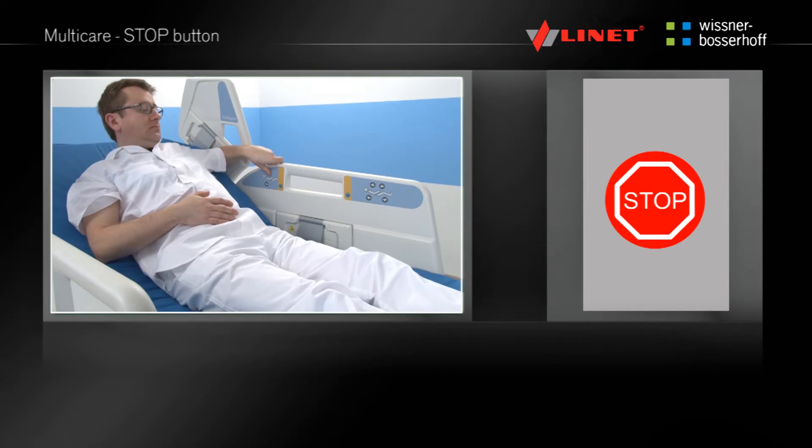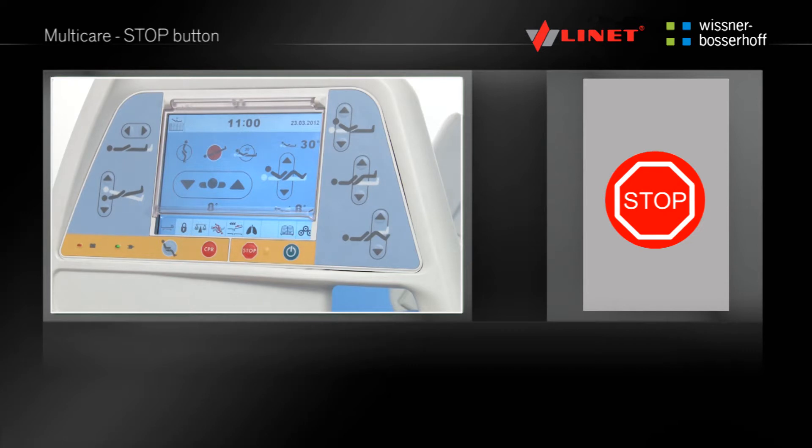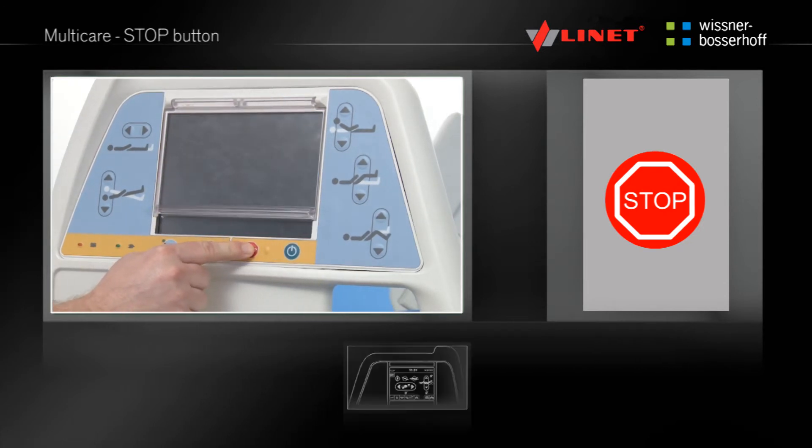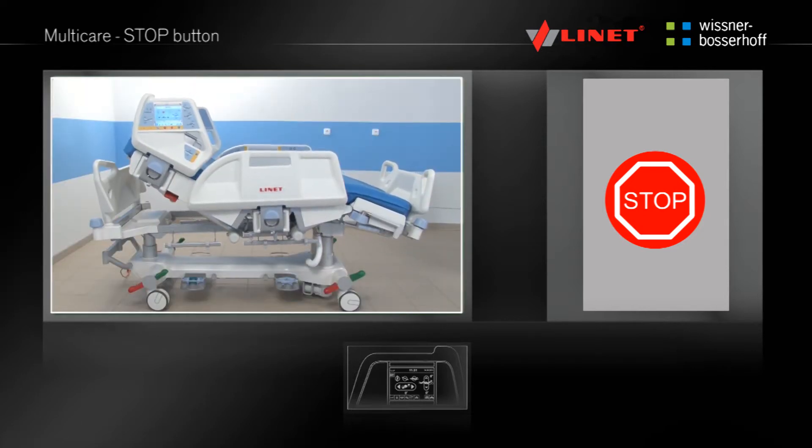The stop button immediately stops all the functions of the bed. It can be used when the patient is activating the bed inappropriately. The stop button can halt any electrical movement of the bed. This function is only located on the Supervisor panel and the integrated side rail controls.